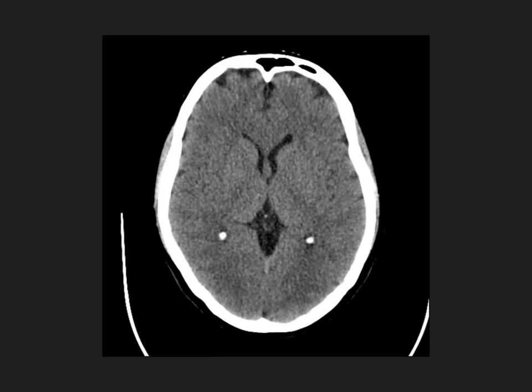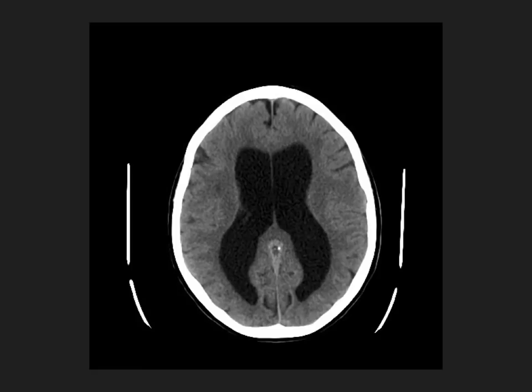This is a normal CT scan of the brain. We can see adequate brain tissue, we see the sulci and the gyri, and really nothing abnormal here. This is what's considered a normal brain scan. Now look at this being normal and then ask yourself what's going on in the next image.